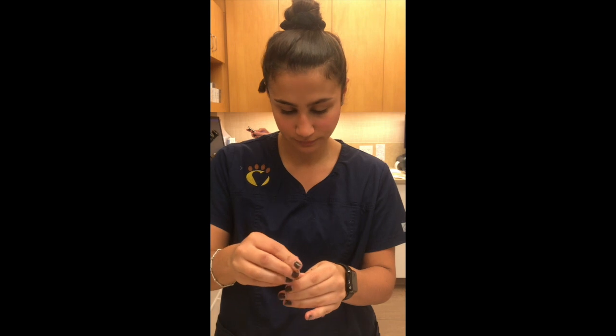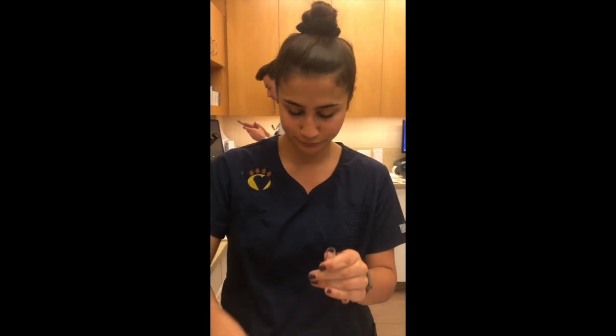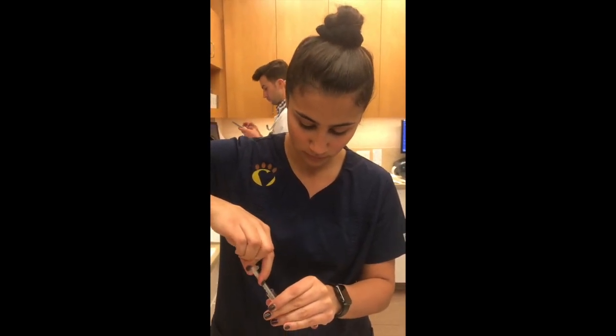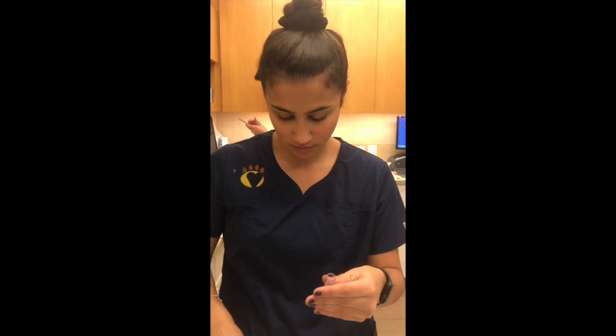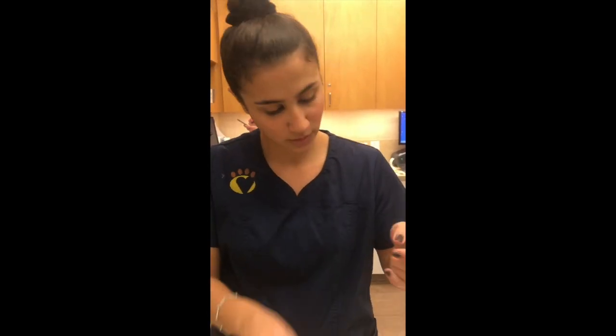And then I'm going to be taking 2 drops of our donor serum. Perfect. Okay, great, now we have our minor cross match.